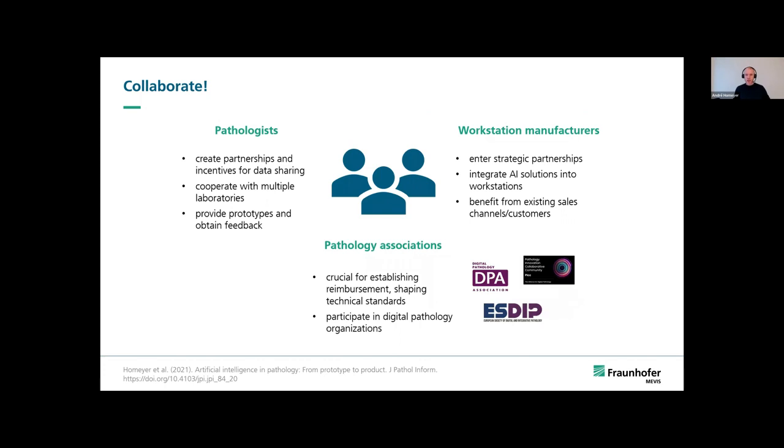In summary, unfortunately, there are still big challenges to bring AI solutions for pathology to the market, but these challenges are best met through collaboration. It's very important, first of all, to collaborate with pathologists. As a small startup, you should always create partnerships with pathologists, and you should give them incentives for data sharing and for consulting and whatever.